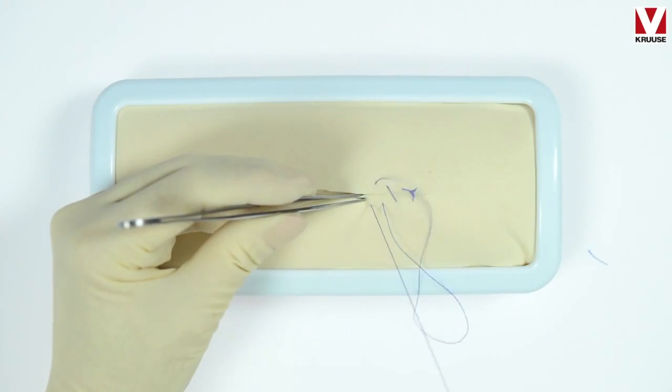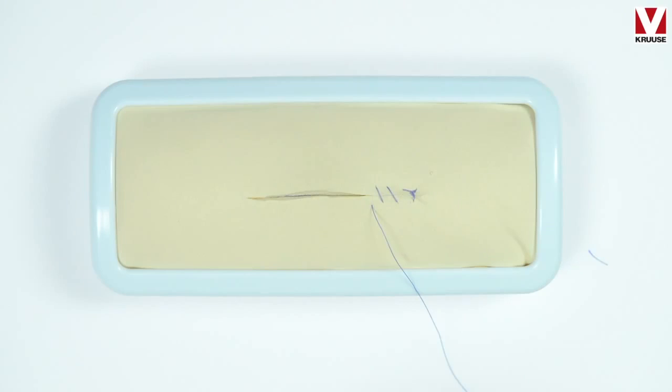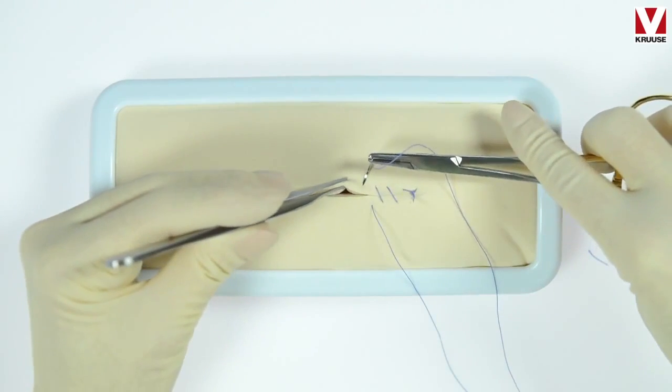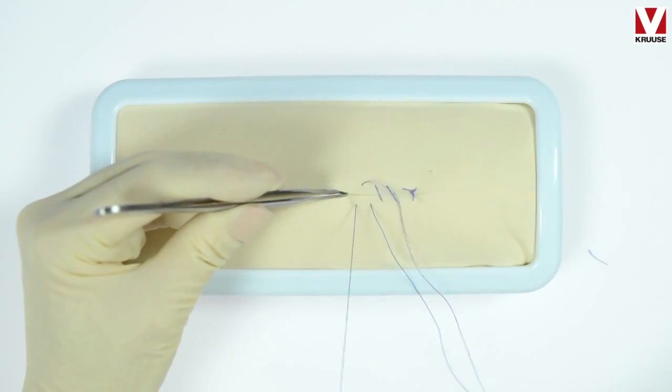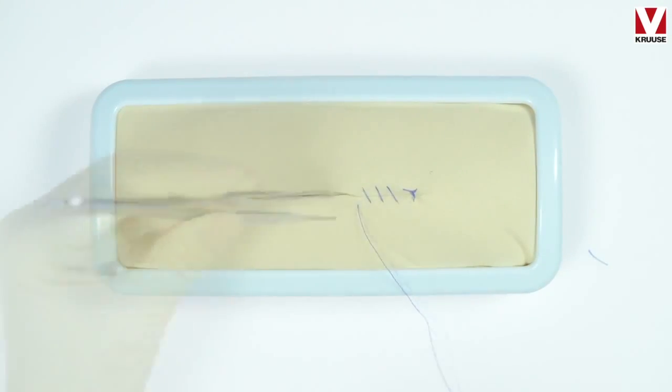If you are using this suturing pattern in the subcuticular layer, make sure that you are using an absorbable suture.